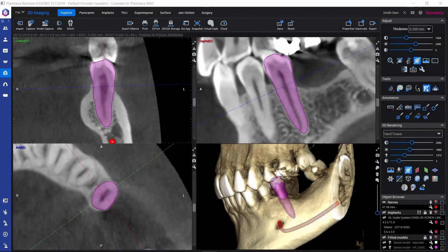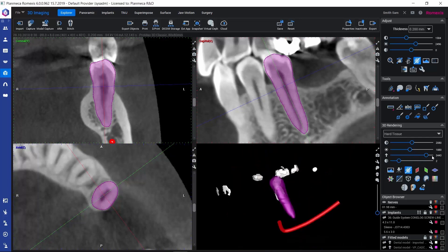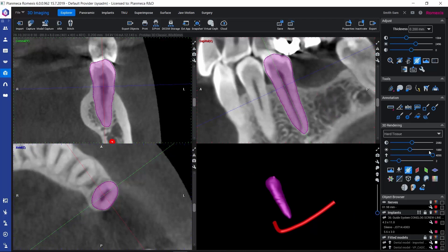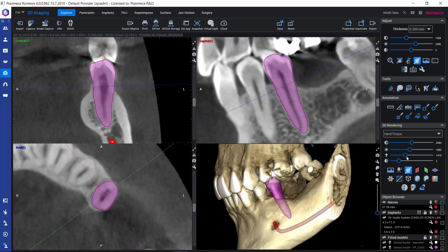The tooth segmentation tool can be used for segmenting single teeth as surface models so that we can better understand their dimensions and their position in the data. We can also examine how close they are to a nerve or to an implant. As surface models, we're able to move the teeth around in the data and we can export them out of Romexis as single STL files.